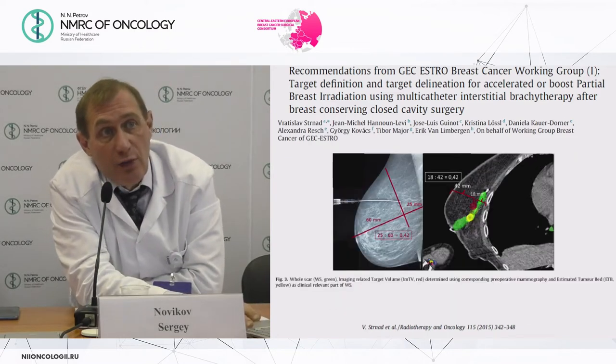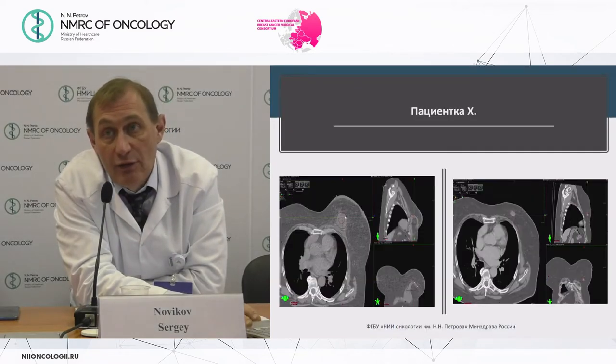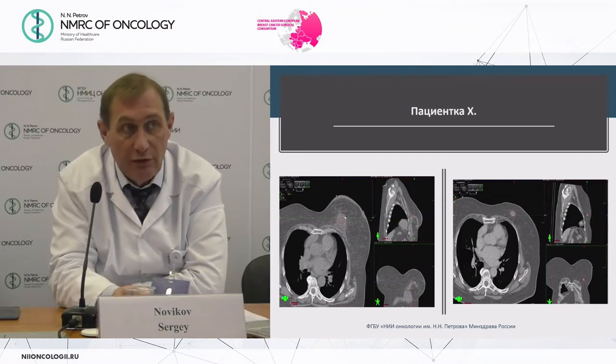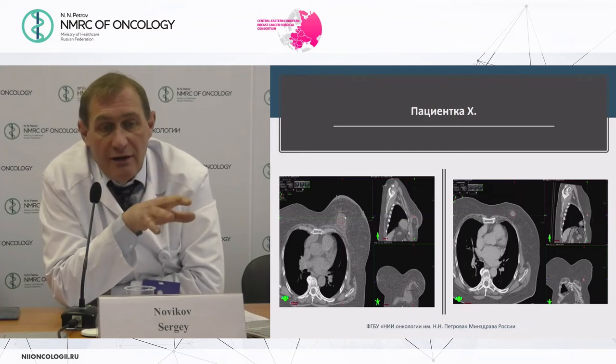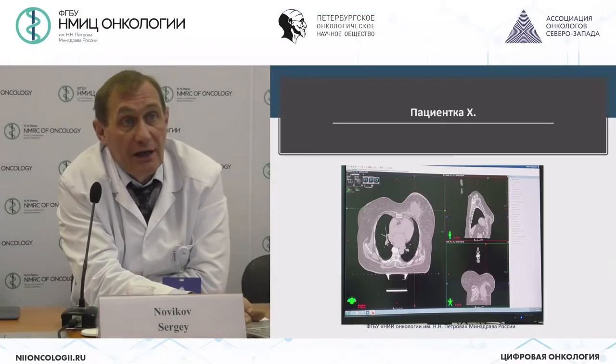And this is how we are drawing the GTV, what we have in real life. This is a patient who was not long ago in our department, and this is a very simple case where everything is very clear. You see the seroma, which exists in about 1-2% of our patients, not more. You see that the clips are on the border of the seroma, which is very logical. In this case, of course, we know how to plan, what to irradiate, and how we can manage this patient.